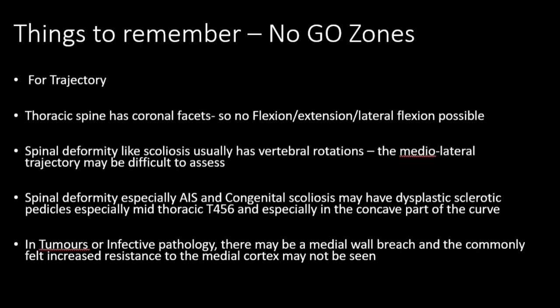So even in case of vertebral rotation, if you stay perpendicular to the superior articular process plane and you stay perpendicular to the lamina mediolaterally, then you can be in the safe trajectory.